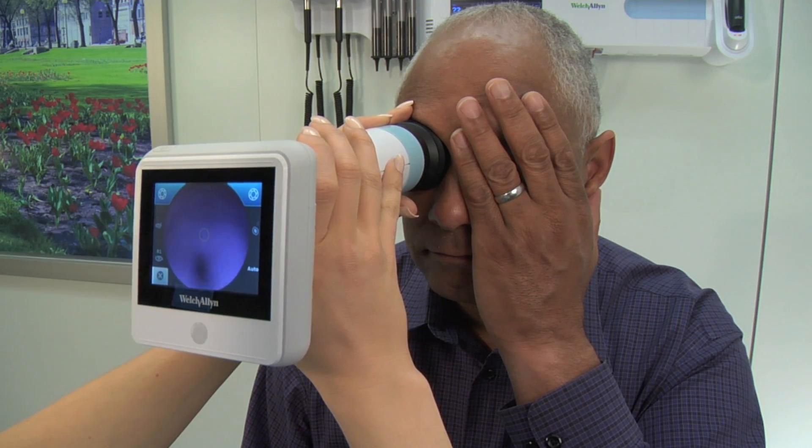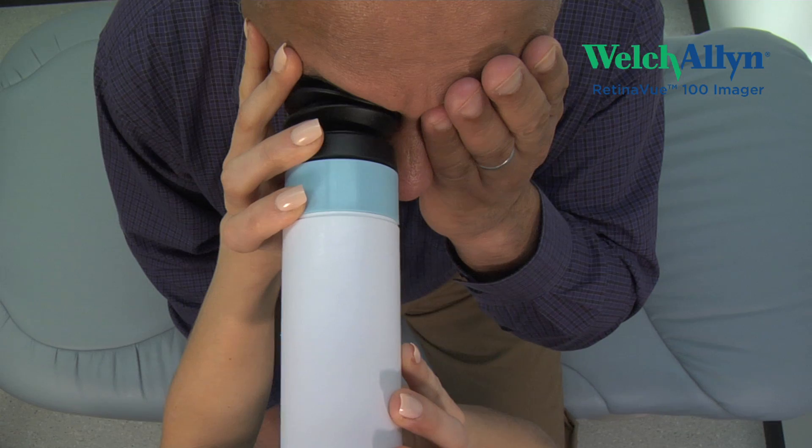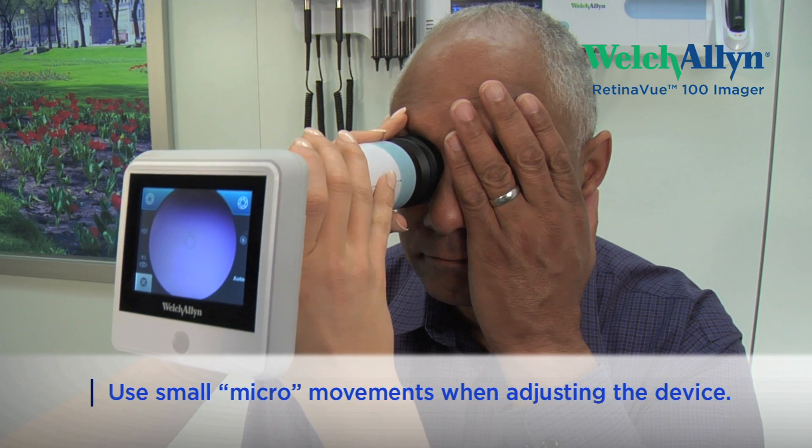The front hand is the hand that you will use to gently guide, reposition, and adjust the RV100 while scanning the retina. Small micro-adjustments work best.